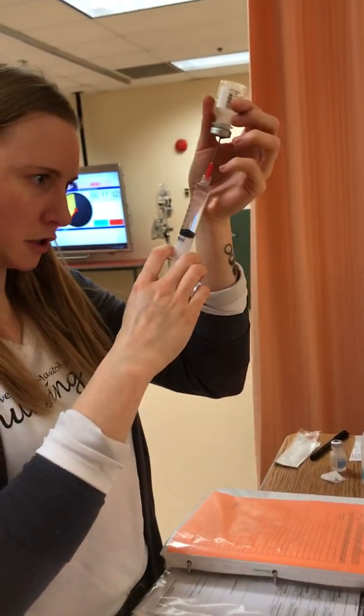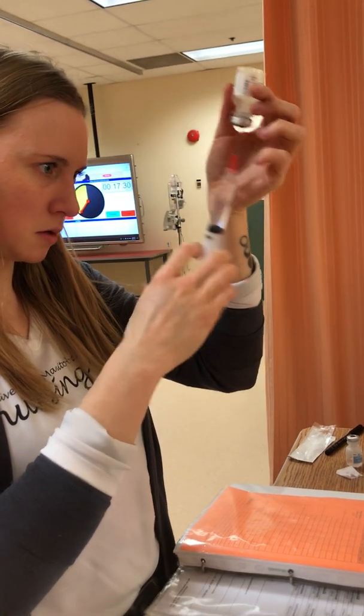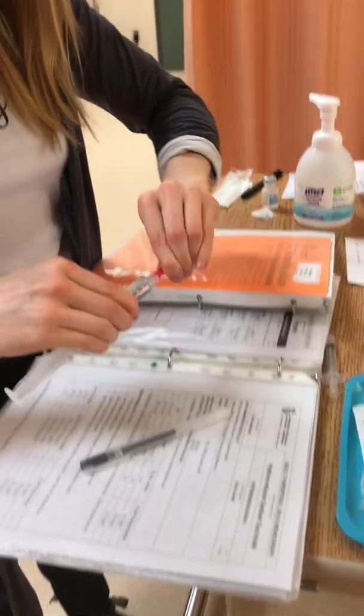Okay, pushing that back up to 8.4. Good. I've got 8.4 milliliters of normal saline.